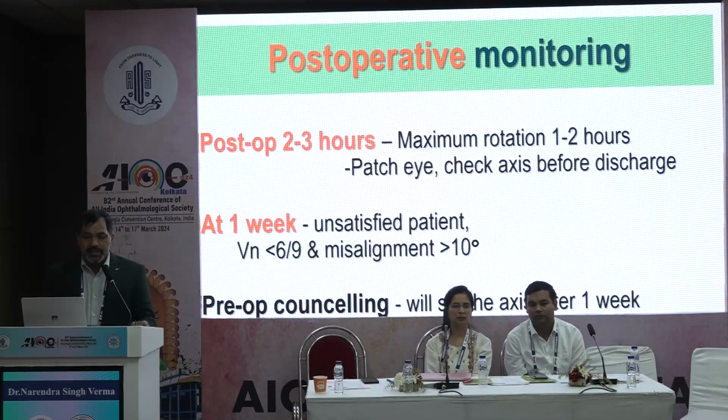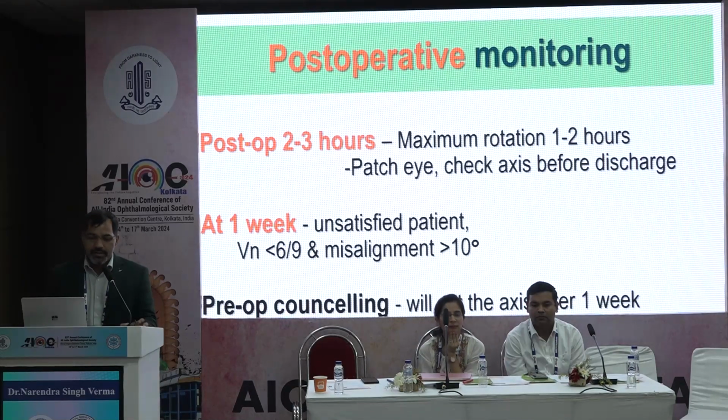Post-operative monitoring: maximum rotation occurs in the first 1 to 2 hours. So you can pad the eye if you suspect that rotation may occur. If proper coverage of the lens is not there on all sides, you can pad the eye, keep the patient for 2-3 hours, then you can discharge.